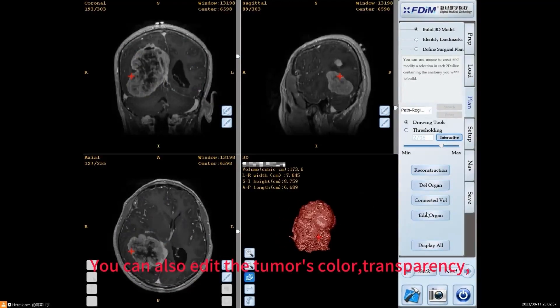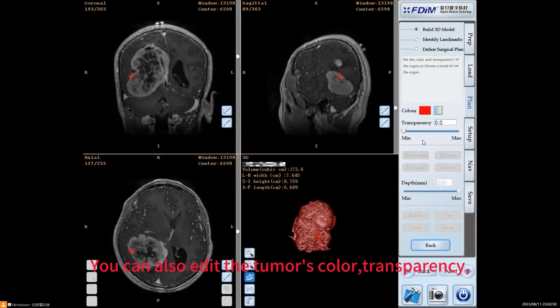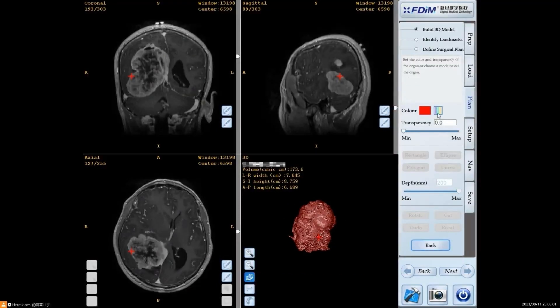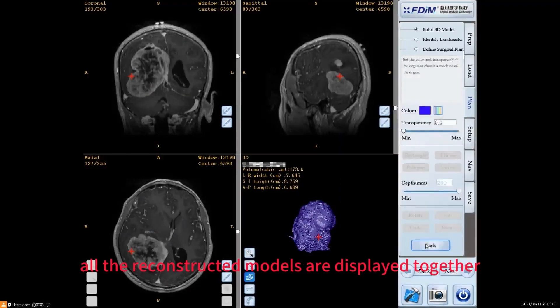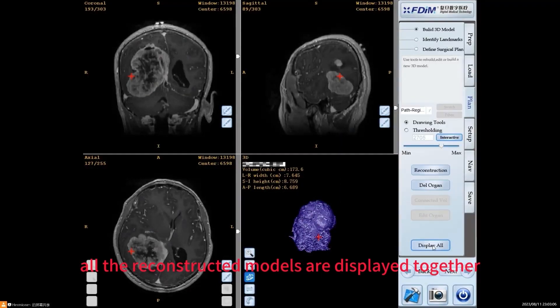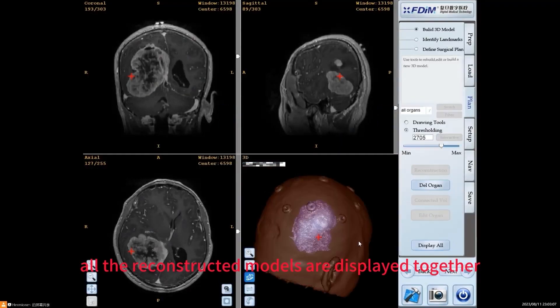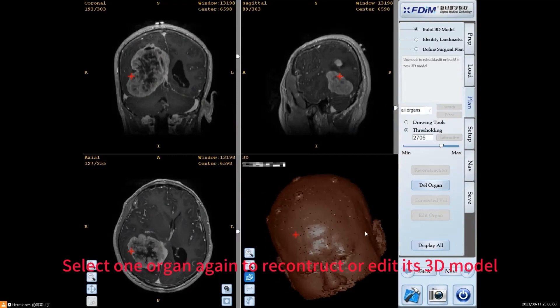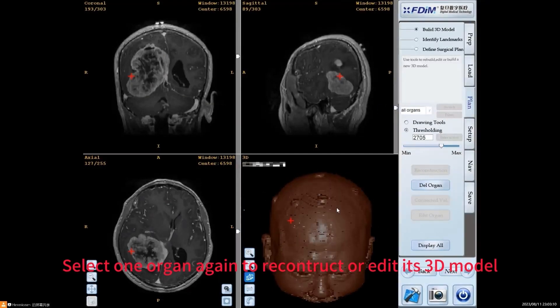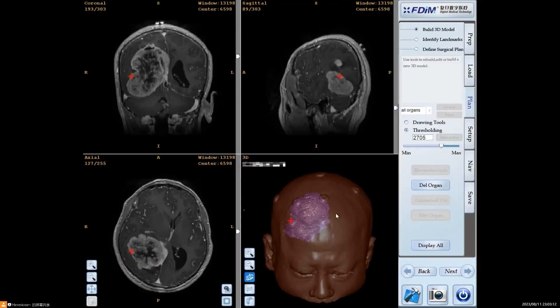You can also edit the tumor's color, transparency, and so on. Click Display All. All the reconstructed models are displayed together. Select one organ again to reconstruct or edit its 3D model.